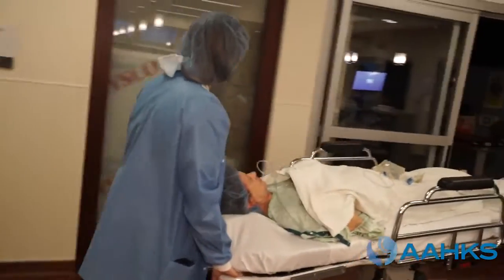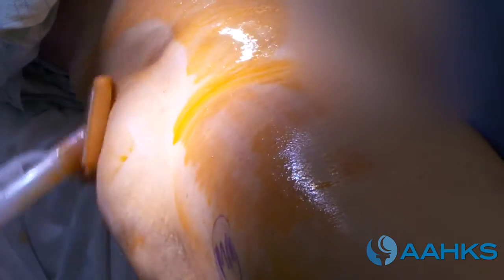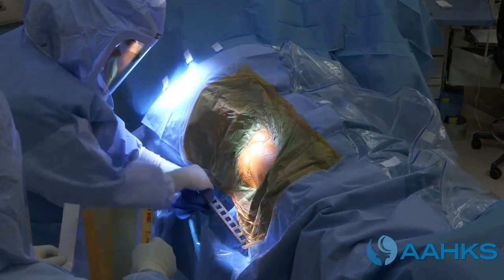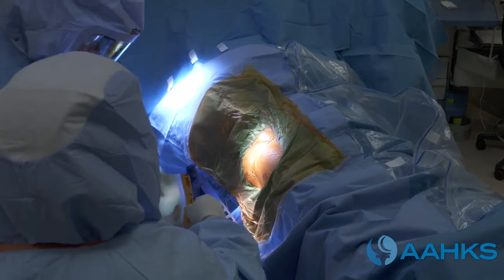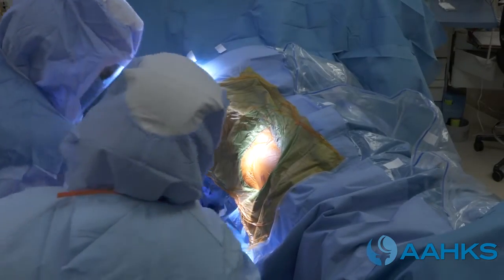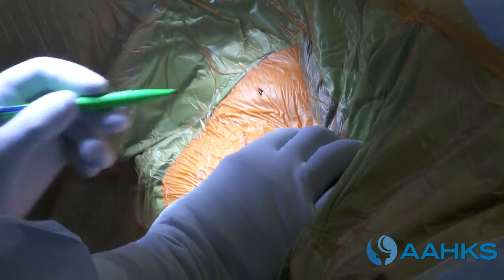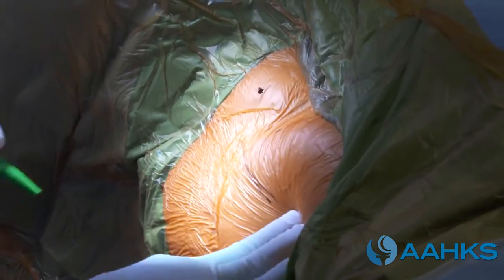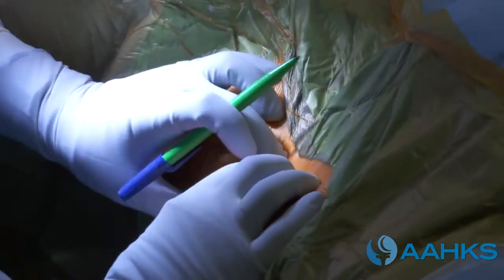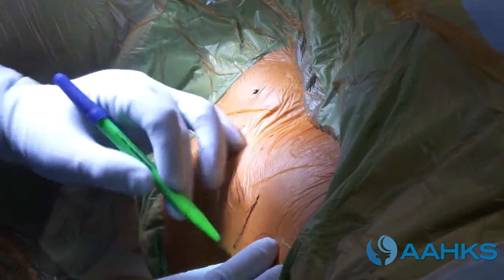Once you're transferred to the operating room, the orthopedic team members apply an antiseptic to the skin of your leg to help prevent infection. Prior to starting the surgery, the surgeon confirms with the team the surgical side, proposed surgical procedure, and that antibiotics have been appropriately administered. Your surgeon will draw landmarks of your hip joint on your skin. The surgeon in this video uses the anterior approach, accessing the space between the front muscles of the hip joint.